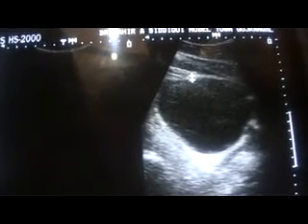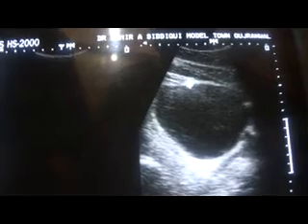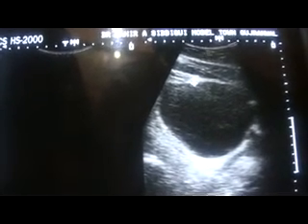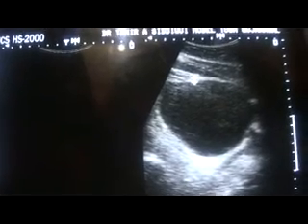Always assess the urinary bladder dimensions with a full urinary bladder, because if we see the urinary bladder only in a partially filled or almost empty state, we will be deceived. Here is the same patient — with full bladder and then post-micturition. The urinary bladder is seen here, and note the difference between the wall post-micturition with a partially filled bladder versus a full urinary bladder.